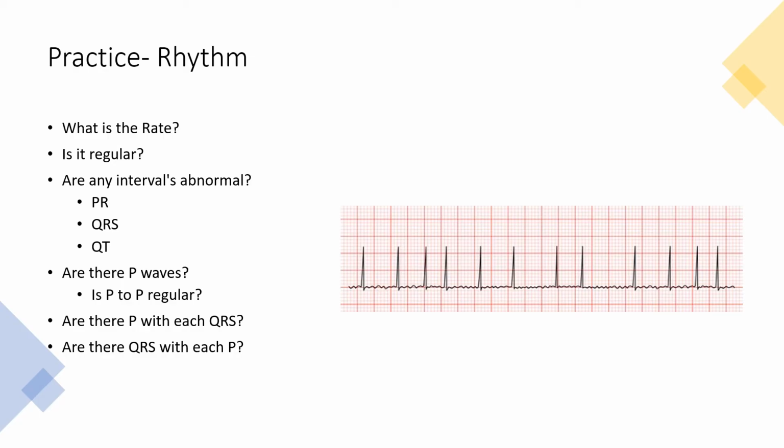First, what is the PR interval? Well, unfortunately, I don't see any clear P waves representing synchronous atrial depolarization. There's a lot of electrical activity going on here, but the morphology of these P waves seems to be different, and it actually looks more like fibrillating atria as opposed to any clear synchronous atrial depolarization. So without active P waves, there is really no PR interval, and that's the first thing that we can identify. Absent P waves and no PR interval.